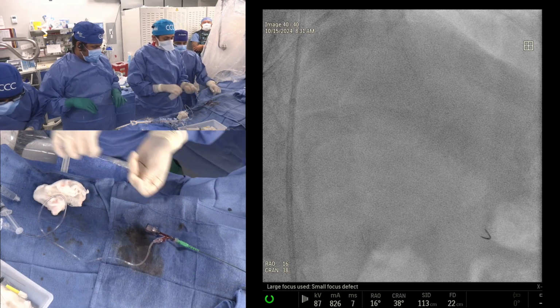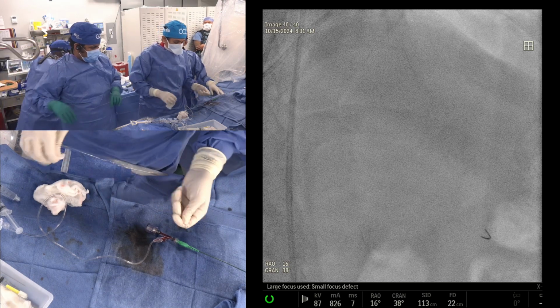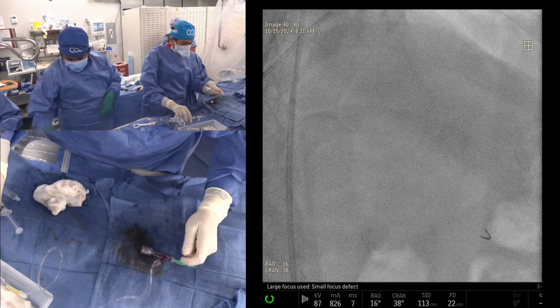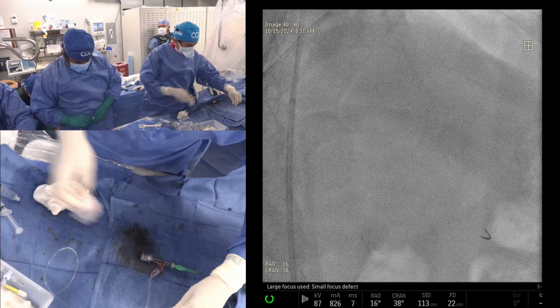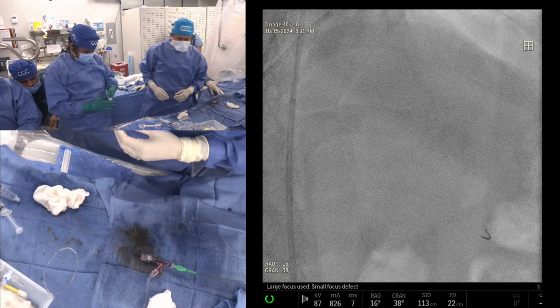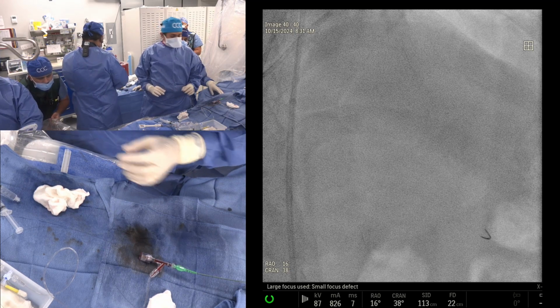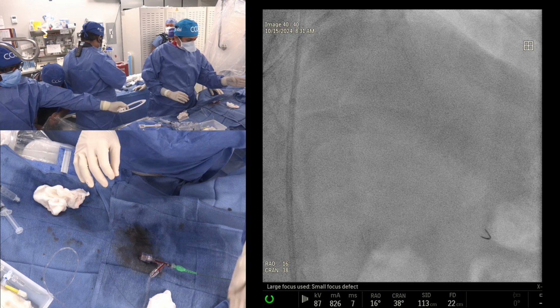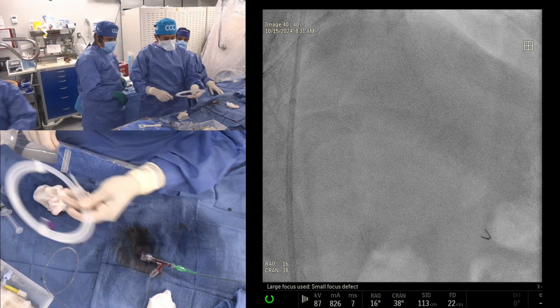And the dual lumen catheters. I understand, but that is what is being taught. Absolutely. It has just never appealed to me instinctively. When you're doing a CTO, you need nice finesse to do it, and just focus on the proximal cap and exit the distal cap.